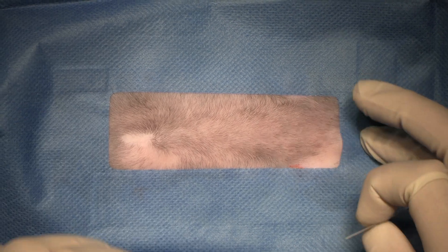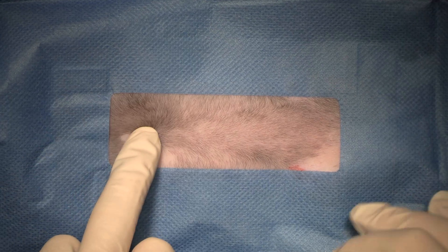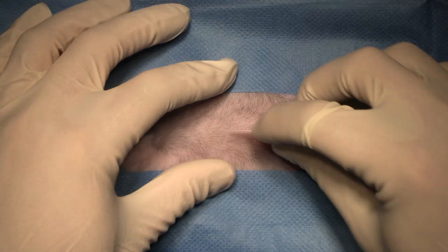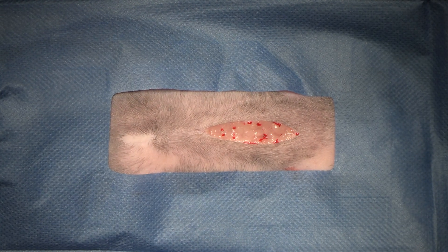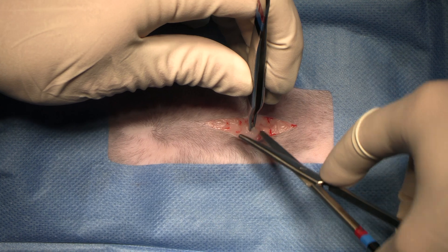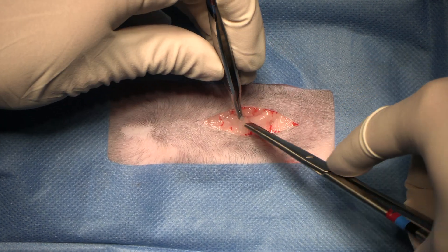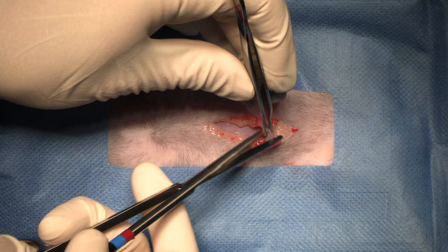We're going to do a spay today on a female cat and we're going to do a one-clamp technique of the uterus. Straight away we find the umbilicus, pubis, thirds, middle third — big and bold through the skin, similarly big and bold through our subcutaneous tissue to expose the linea alba.